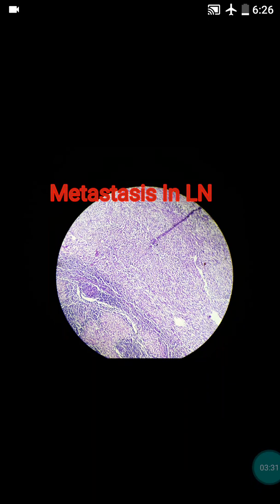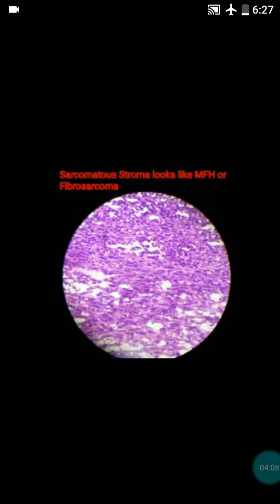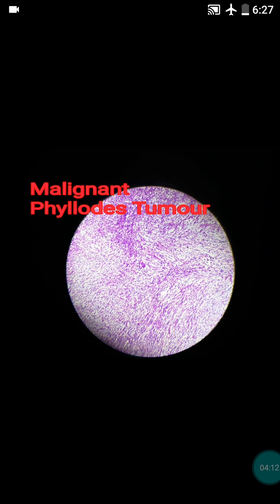Another differential diagnosis to consider is metaplastic carcinoma of the breast, but in metaplastic carcinoma there is pleomorphism and atypical features in the glandular elements as well, whereas in our case the glandular elements were totally benign. Metaplastic carcinoma also shows squamous metaplasia and spindle cell variations. Importantly, this case was ER/PR positive, whereas metaplastic carcinoma is negative — so our final diagnosis was malignant phyllodes tumor.